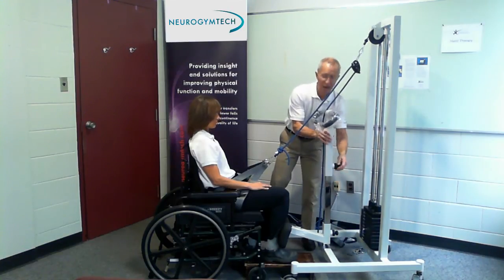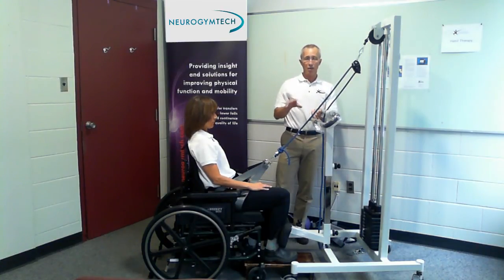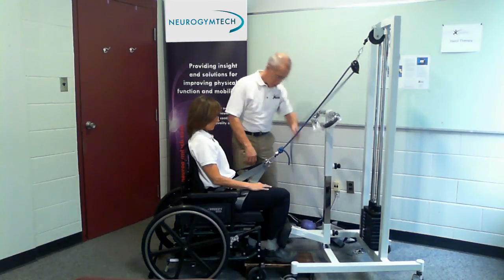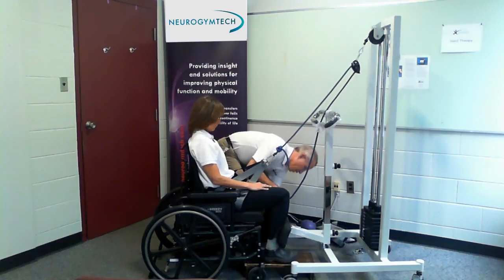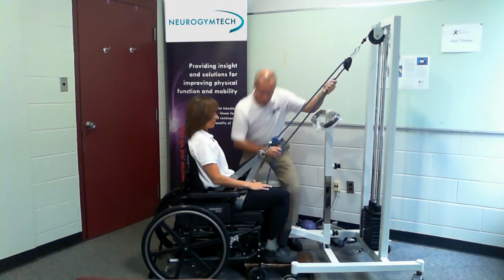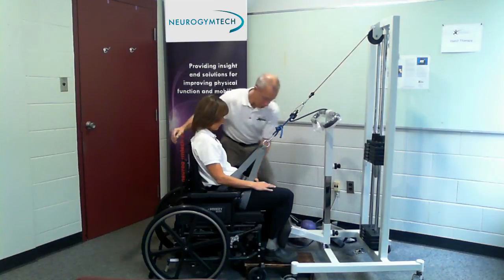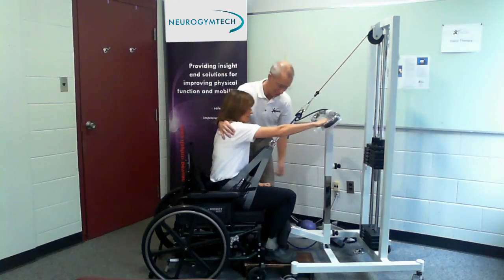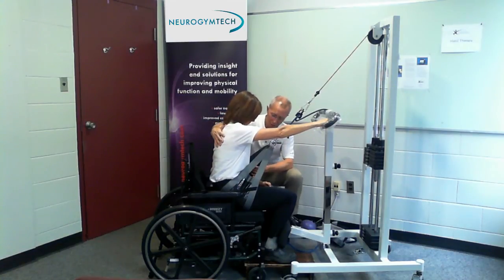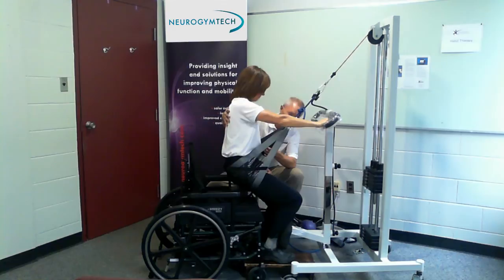I'm going to move the handlebars up higher than normal. The typical height is usually about eye height, but for this patient I want them a little higher. Make sure her heel is on the ground and the tibia is angled slightly backwards. Engaging the weights with the patient sitting back. Now we'll have her good hand — her right hand — up here. Slowly come halfway up, and then back down. They can feel the focus on the affected side. This patient walks around and ambulates just fine, but she's weak on the left side, so we're able to do intense functional training on that left side.